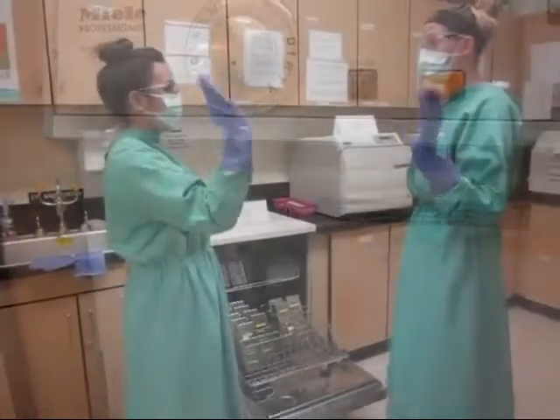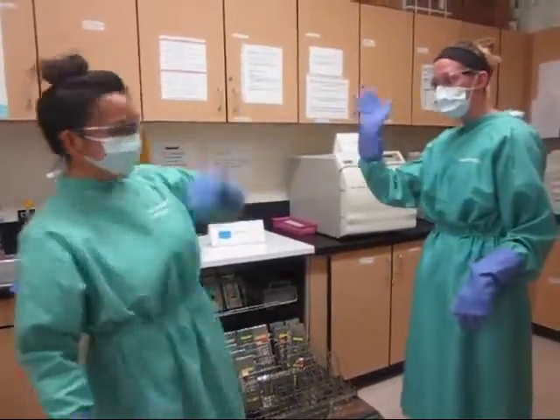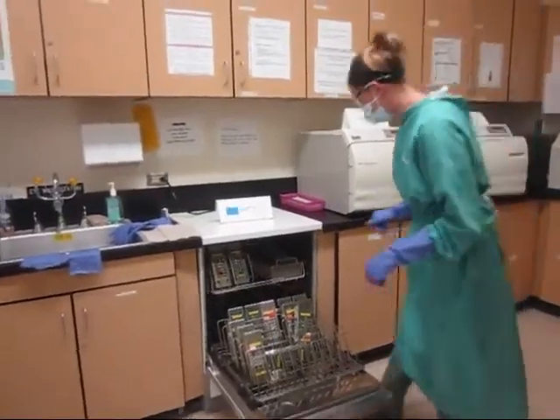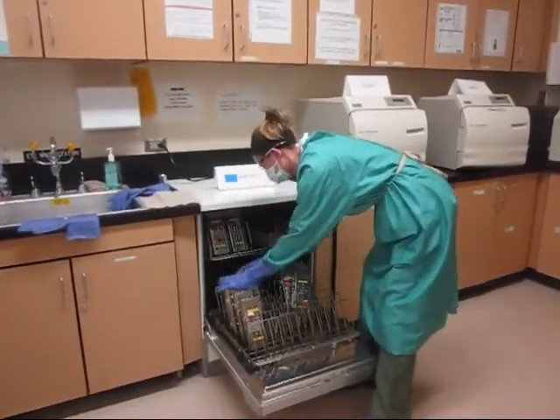The sterilizer in the clinic today is Nadine. Nadine greets Frances and offers her help. The clinic is a dental team where everyone lends a hand. Nadine has discovered a mess. She spaces the cassettes evenly, making sure all sides of the cassettes will be exposed to high-powered jet spray.